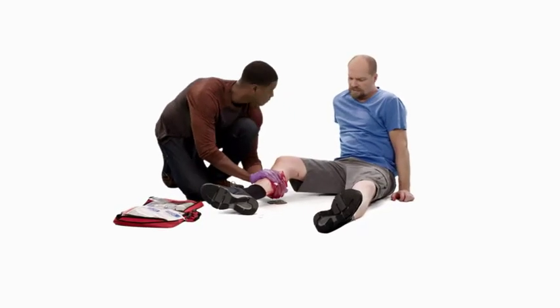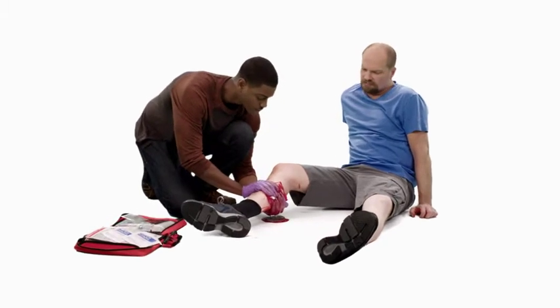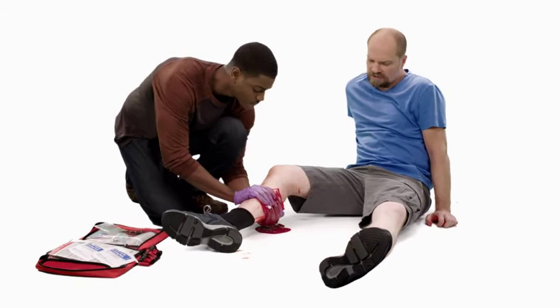A tourniquet should be used, if available, when life-threatening bleeding exists on an arm or leg and standard first aid procedures fail or are not practical.